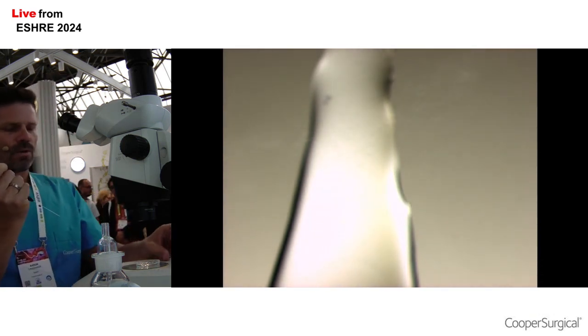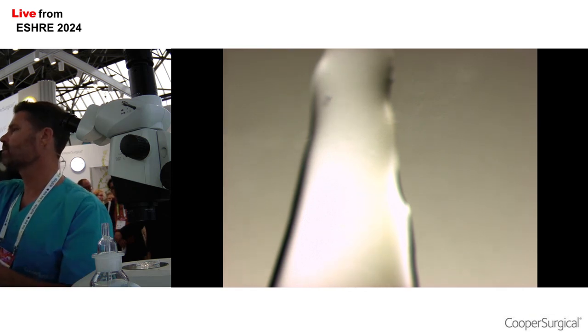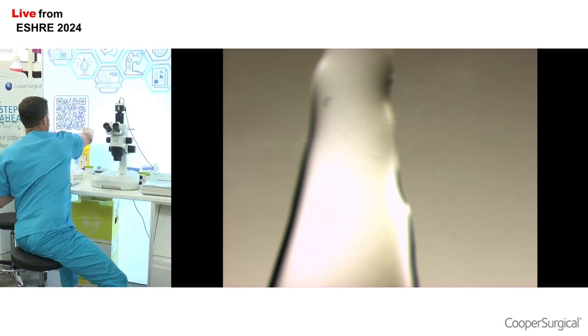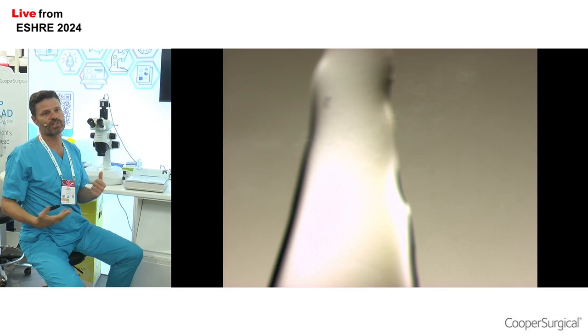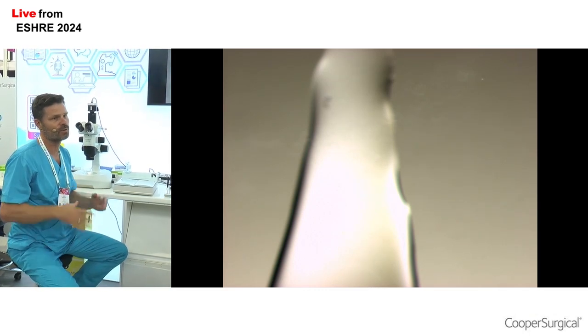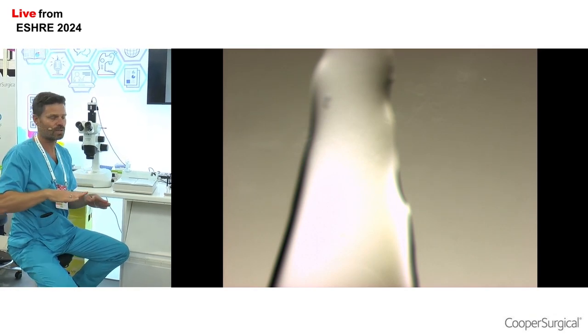Okay. So now the sperm will migrate down to the area where the hyaluronic acid is, and hopefully the sperm, as Dave said, which express receptors for hyaluronic acid and have less DNA fragmentation, will start reacting with it and they'll bind. We're going to see in a minute what this binding effect looks like.